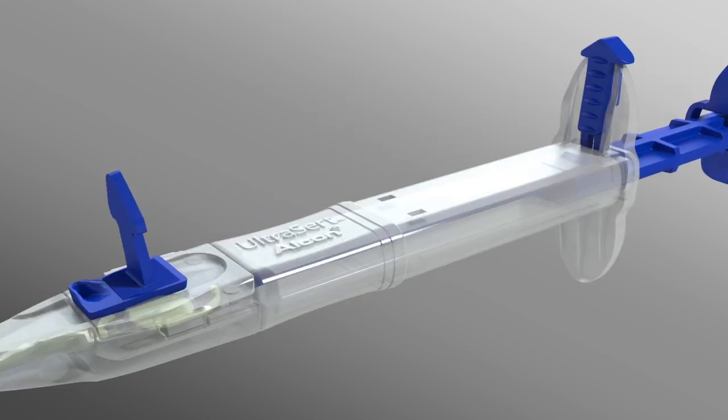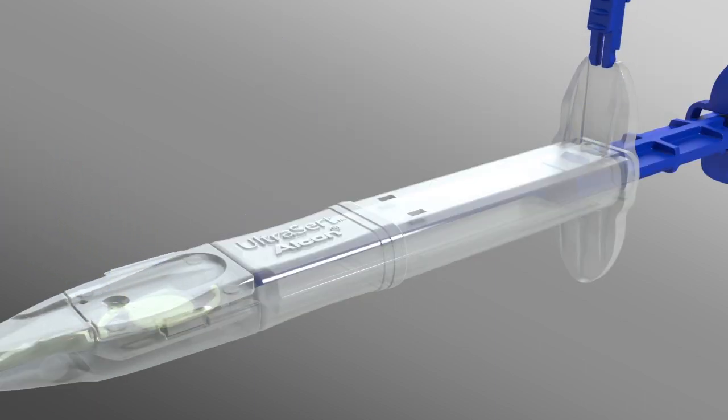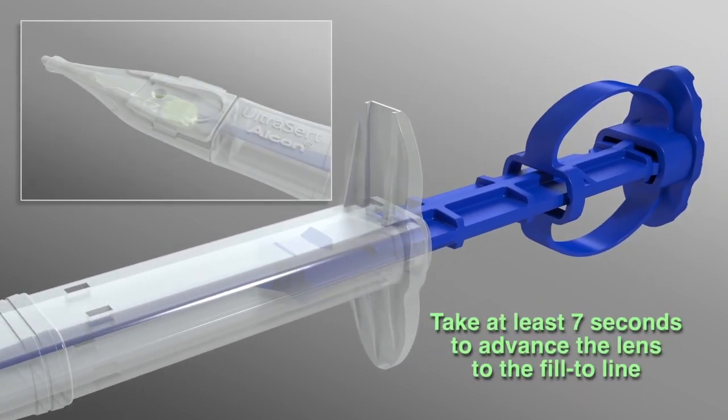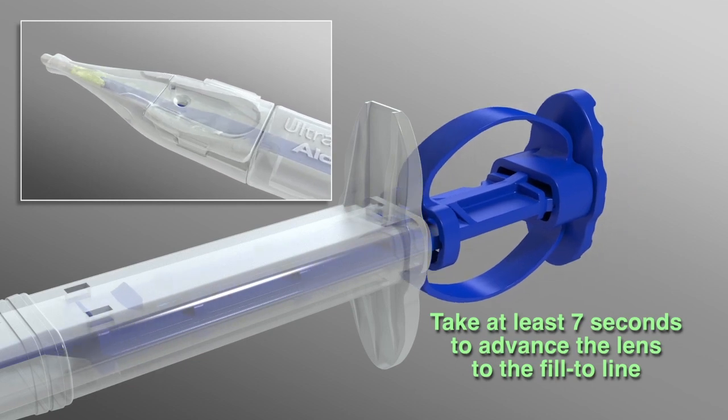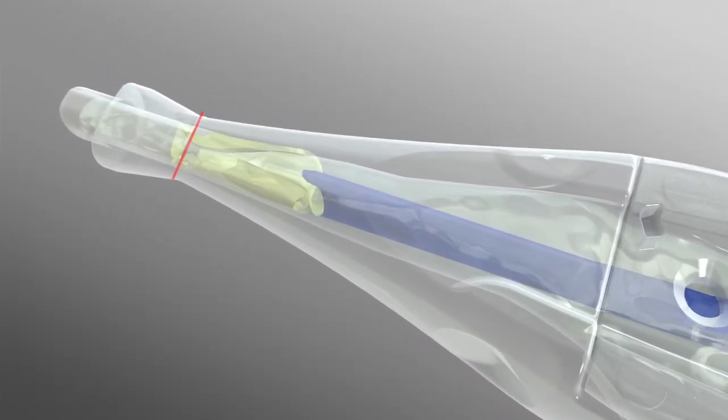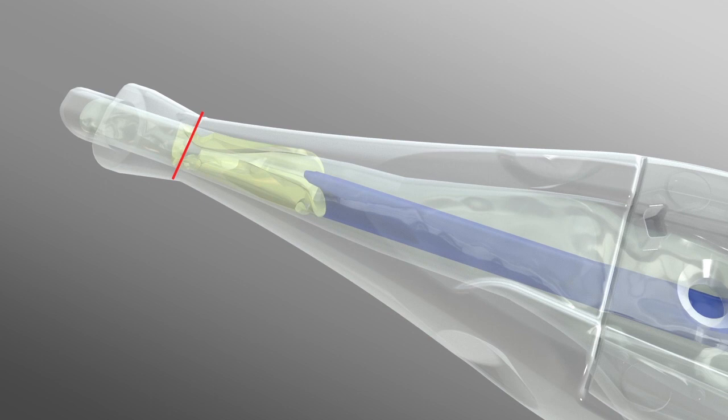Second, remove the lens stop and plunger lock. Finally, take at least seven seconds to gently fold the lens by advancing the plunger forward in one smooth, continuous motion until the front edge of the optic is even with the fill-to line.